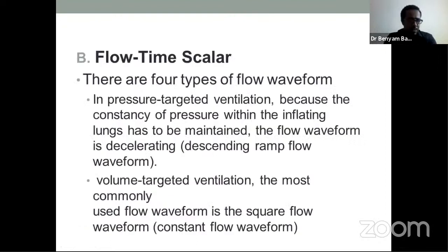Okay, so far we've seen the pressure time scalar. The next discussion will be on the flow time scalar. On most mechanical ventilators, we have 4 types of waveforms. It depends on what ventilation we are giving. Is it pressure targeted or volume targeted?